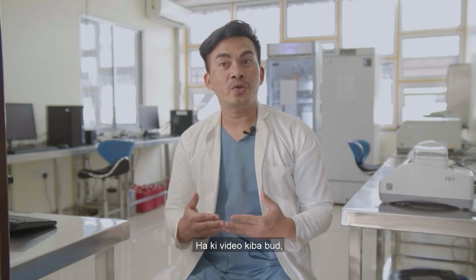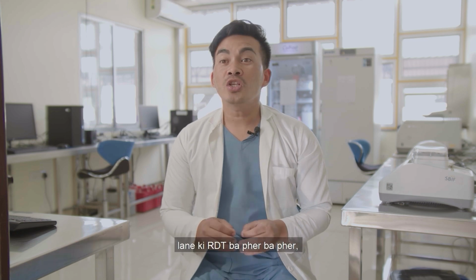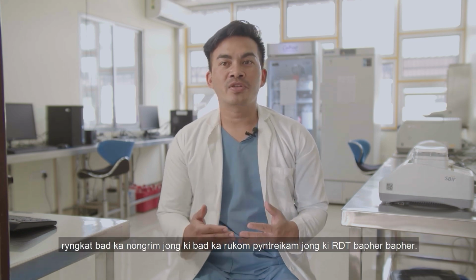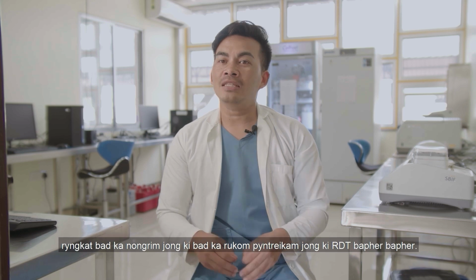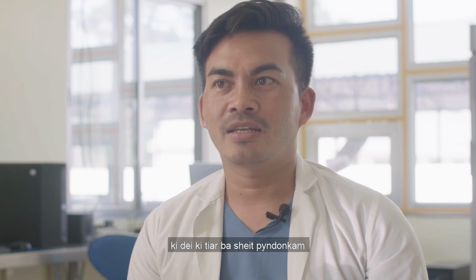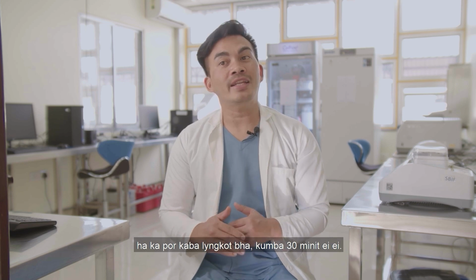In the following videos, we'll be learning about the different types of rapid diagnostic tests, also commonly known by the shortened name RDTs, their basic principle, and method of using and sorting the kits. Rapid diagnostic tests are, as the name suggests, kits that are used for diagnosing infections or diseases within a short time period, usually within 30 minutes.